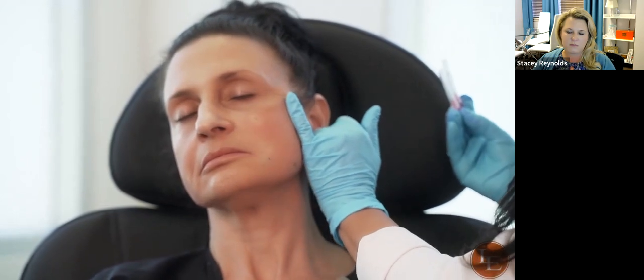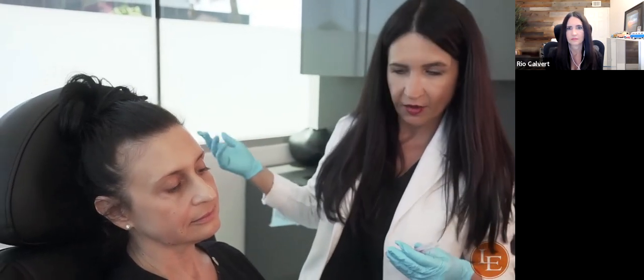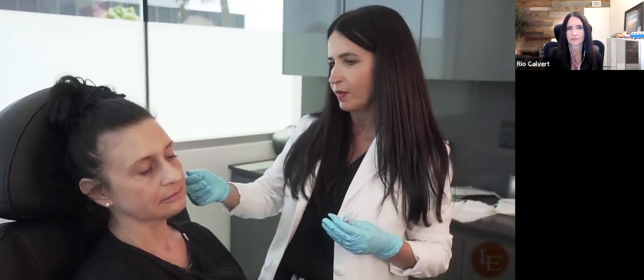You can do a hashtag to support the marionettes, hashtag to support the nasolabial folds, a sundial pattern along the jawline to tighten it up, enhance the cheek by placing a sundial or hashtag pattern to support upper cheek tissue and build volume, and support the submentum with the hashtag pattern as well. Basically anywhere you can put smooth threads you can put them in any pattern to produce collagen, thicken and firm skin, produce elastin — lasting from one year to a year and a half to two years.